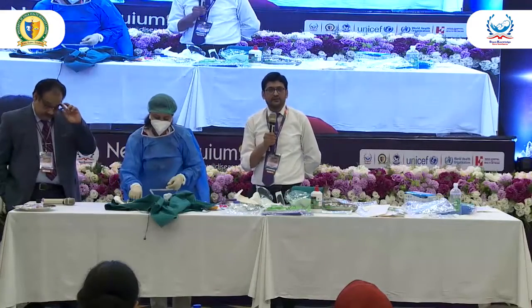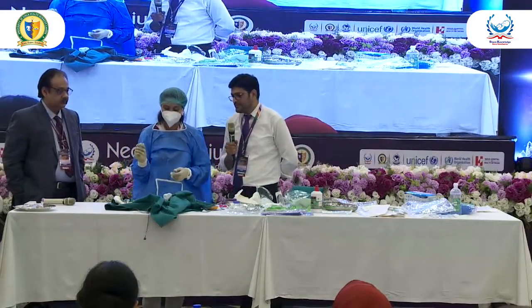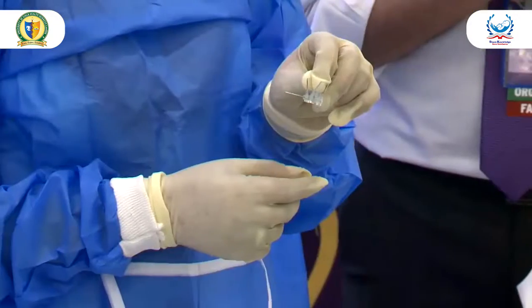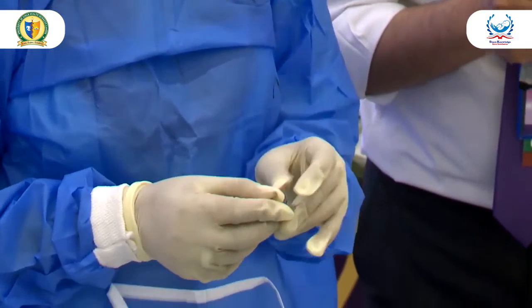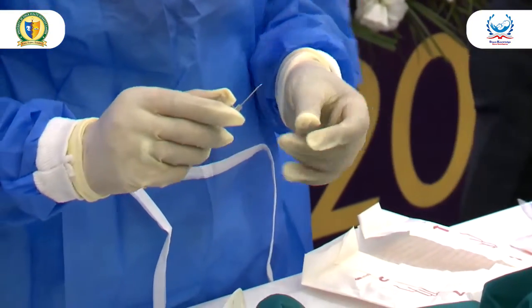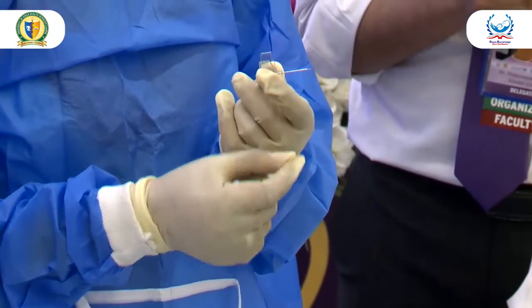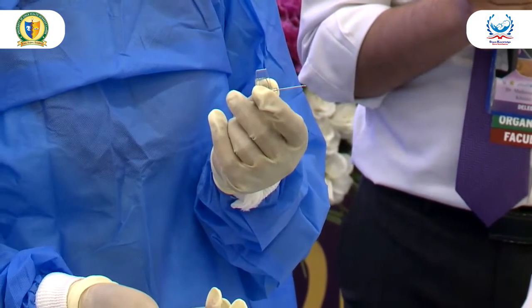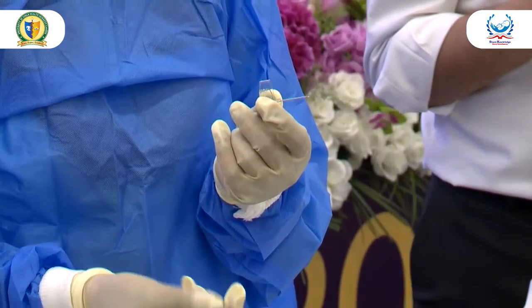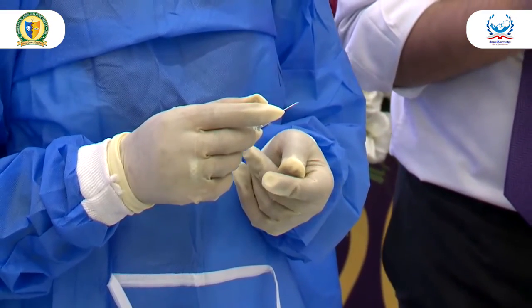Now we are ready for the prick. Just to tell you, this is the needle which is breakable. What Irfan showed is some cannula, a plastic thing which is breakable. Whatever you have, the technique is the same.